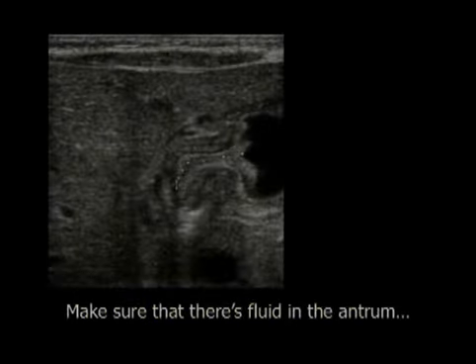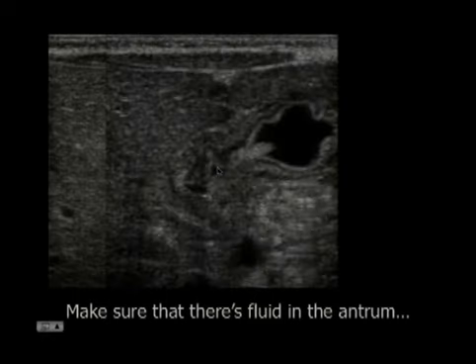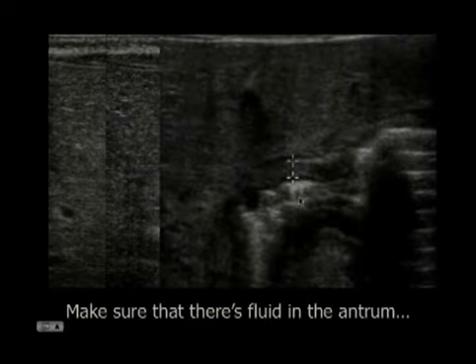So in this child, we haven't rolled him up on his side. He's lying supine. We do have some fluid over here in the antrum, but you can see my sonographer here has measured an elongated channel, but it's not thick. And as we roll the child up and get that fluid to go into the antrum, you can see that eventually the whole pyloric channel opens up. This muscle thickness is only about 1.5 millimeters. Fluid and air is seen to pass through, and this child is completely normal.